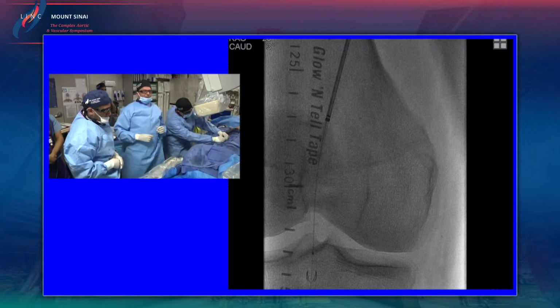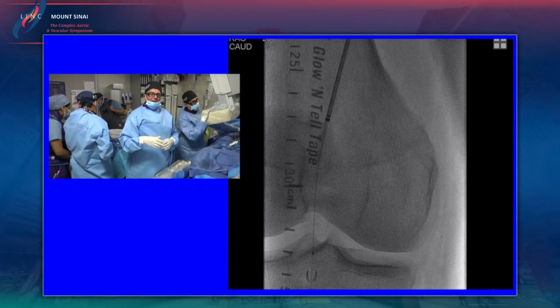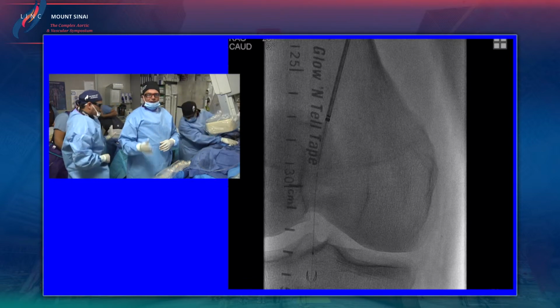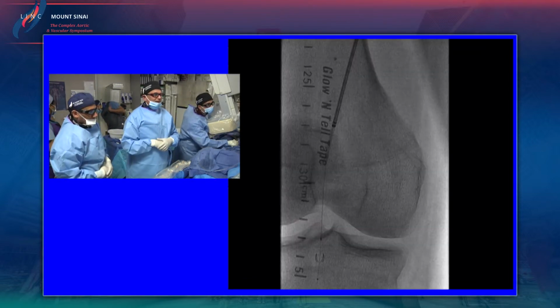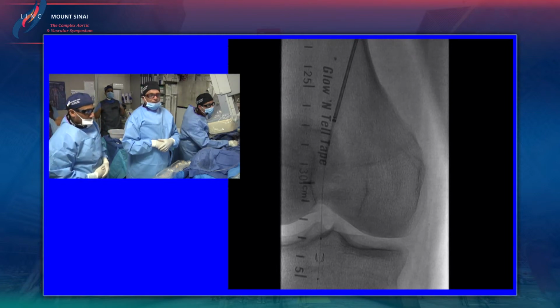That's one of the questions I think a lot of people have: how do you deal with that problem of having a Supera that's restenosed, and now you're going ahead and putting another stent in when you're not using another Supera. So I think this is an issue, and hopefully in this case we don't have to do that.